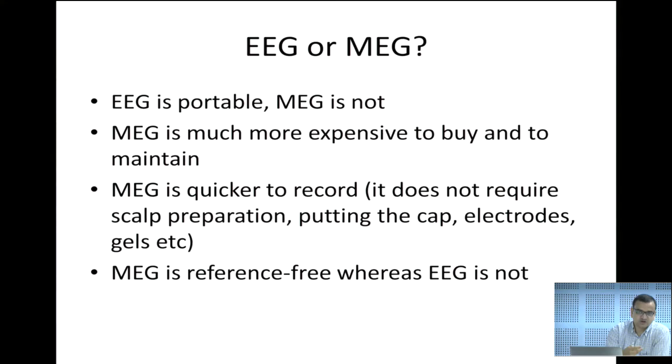Although you might think just saving time may not be that important, it has a big advantage. Suppose you're working with patients or vulnerable populations who are less cooperative, or some people who don't like all these things on their head. MEG is less intrusive. You just sit there, something big comes over you, and you're not allowed to move. That's it. But otherwise, in clinical settings, especially for certain groups of patients, MEG offers a practical benefit.